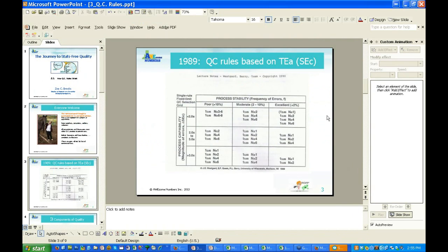Because when we looked at another alternative that Westgard was talking about with the QC selection grids, if we look only at the excellent method stability, he was saying when you use a rule for a method with a critical systematic error less than 2, for one control in a run, you would use a 1-2S rule, and I don't know if that's still a warning.